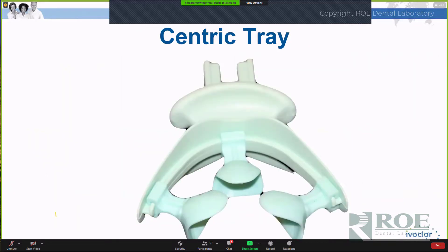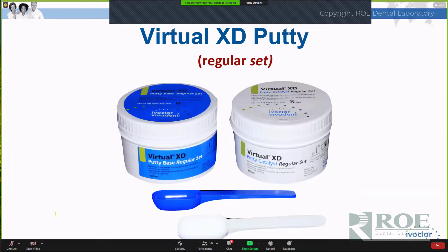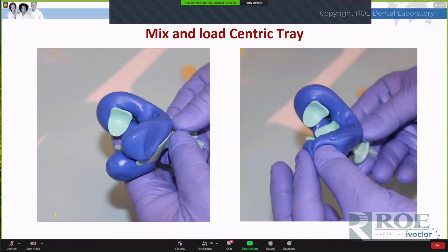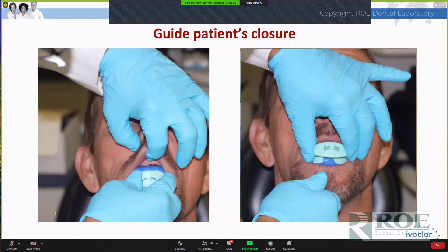This is the centric tray - basically a scaffold that has a little tongue guard with some projections. These are little tongue guides that help keep the tongue at bay while doing the jaw record. The material I like to use here is the putty - impression putty. I like to use the regular set; it has a fast set but that's too fast for me. I'm trying to do this bite registration and I want a little extra time. We load the tray with this putty - it's two parts that you mix together - then insert it in the patient's mouth.